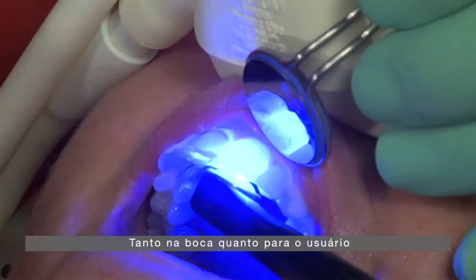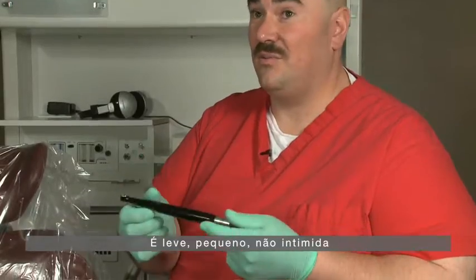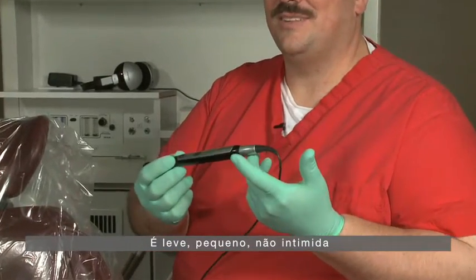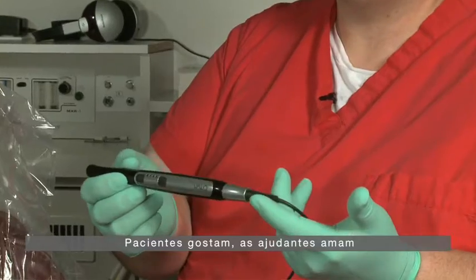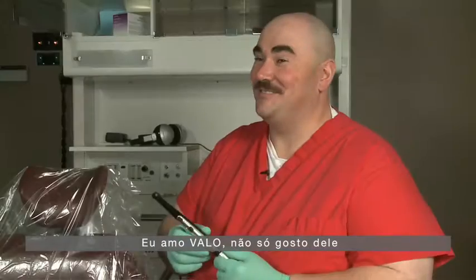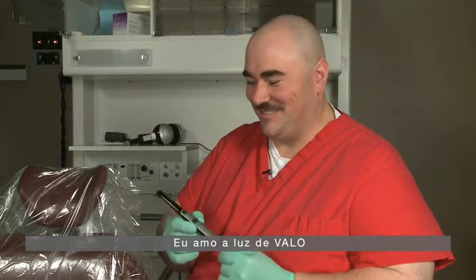The VALO is very ergonomic, both in the mouth and for the user. It's lightweight, it's small, it's not intimidating. The patients like it, my assistants love it. I don't like it — I love the VALO light.